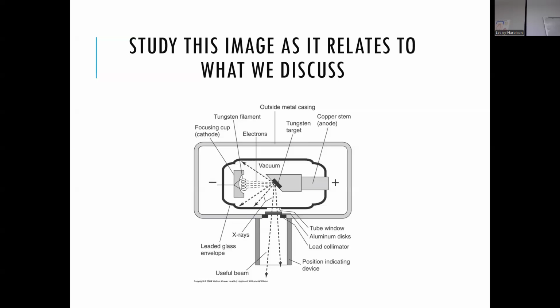I know you can't tell it's metal, but the blue part in that picture is a copper stem, so you could write copper stem. It has a specific purpose, and we'll revisit it, but I'll tell you because I always jump ahead: it's just to absorb heat. Copper absorbs heat really well, and so that big chunk of blue is a copper stem.